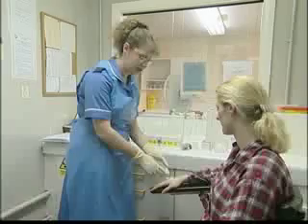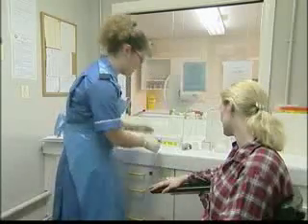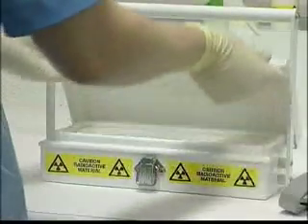What I'm going to do now is give you an injection through here. The injection I'm going to give you, as I said, is very slightly radioactive, but it won't make you feel strange.